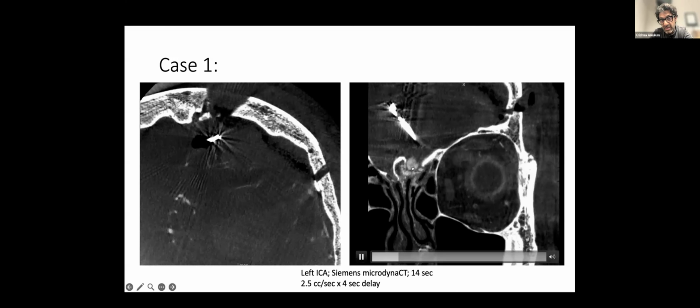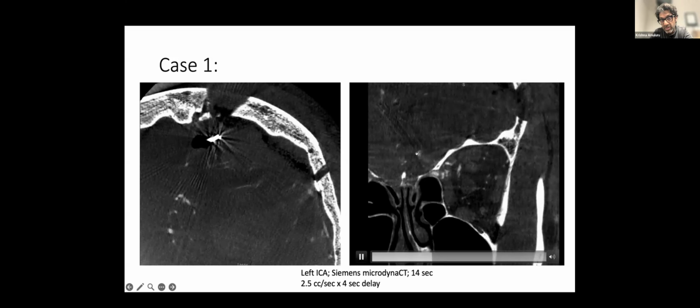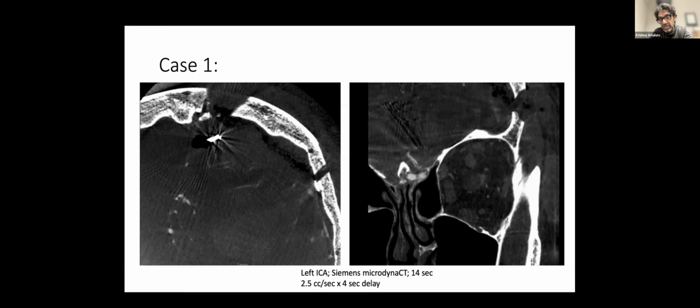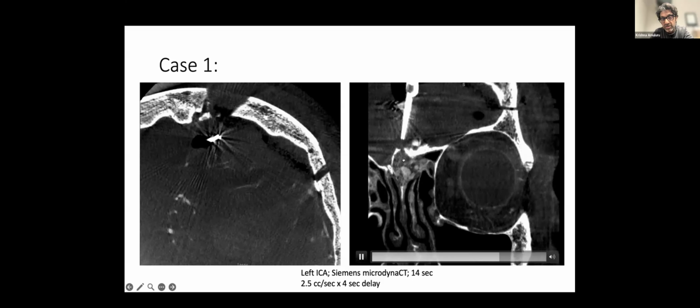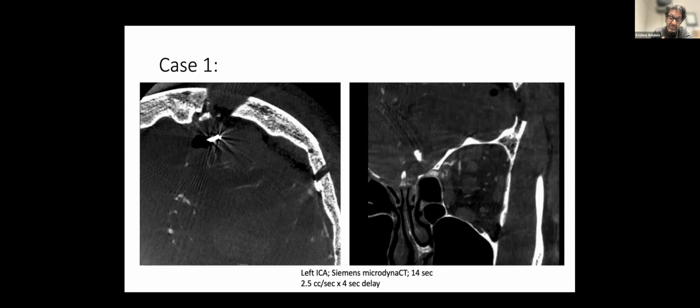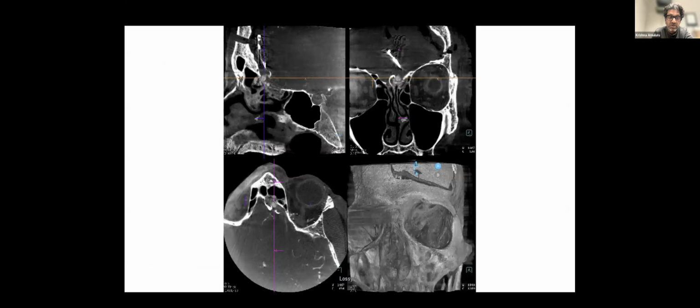You can actually see the varix coming out. There's a hyperdensity from where the extravasation is. You can see that it's inferior to the level of the most distal clip blade, so there's still varix here. But despite the fact that the venous outflow has been occluded, there's now just this empty blind venous pouch with arterial flow. Here are the MPR reconstructions.